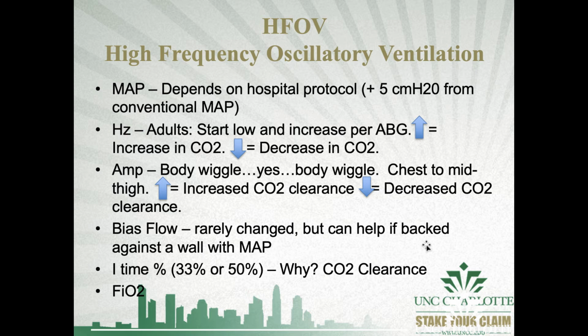If you have a decrease in your CO2, okay, so that gives you some wiggle room, right? You're going to always increase your hertz. So ideally, you want your patients at the highest hertz you can possibly provide with the appropriate level of hypercarbia. Now, we're going to accept permissive hypercarbia in this situation as well as APRV. I left that part out.